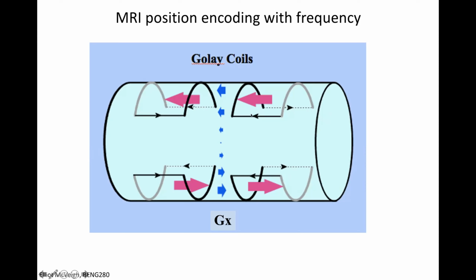So now I pulse current in this coil in this direction. And I use the same right-hand rule. I can increase the Z field at this position. So for X increasing, I have increased the Z field.